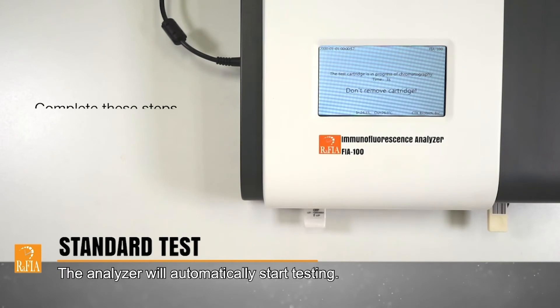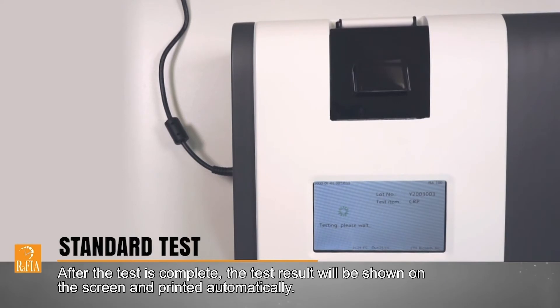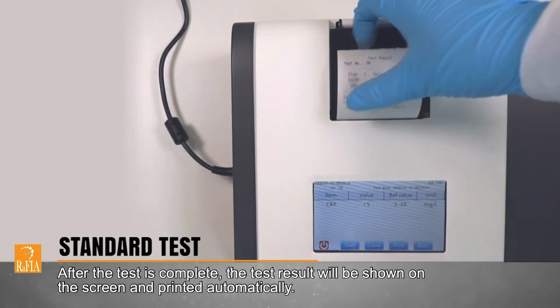The analyzer will automatically start testing. After the test is complete, the test result will be shown on the screen and printed automatically.